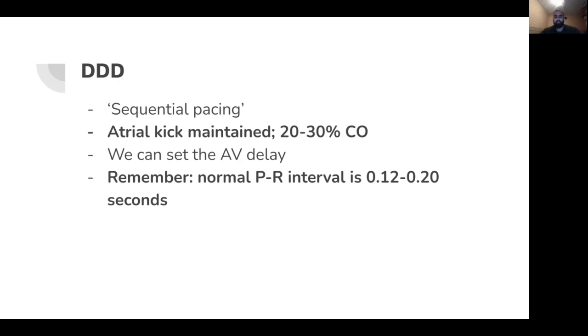You may get the opposite. You may get that the atrial conduction is fine, but that not every P wave is followed by a QRS complex, in which case it will pace the ventricles after the atria, in those cases where the ventricular depolarization doesn't come on its own. And really that's how DDD mode works.